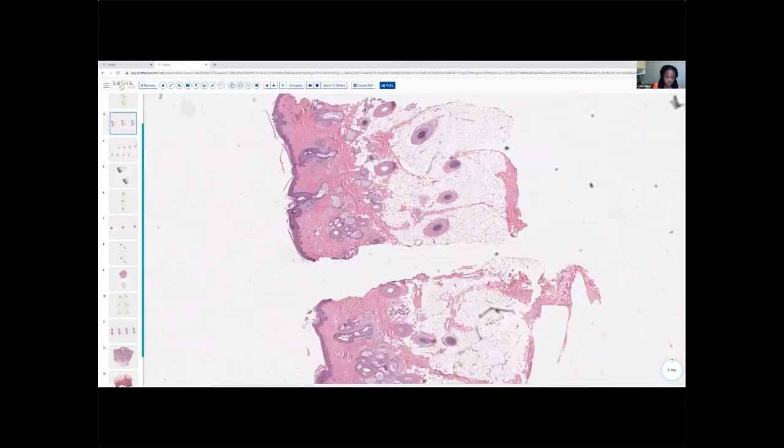And again, what's really striking is just the level of miniaturization compared to the little bit that we saw with the traction alopecia, where the most striking finding was really that catagen telogen shift. And then we were lucky enough to see those pigment casts with some distorted hair shaft remnants. Okay, so keep these two in mind.